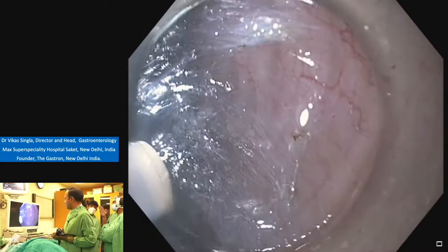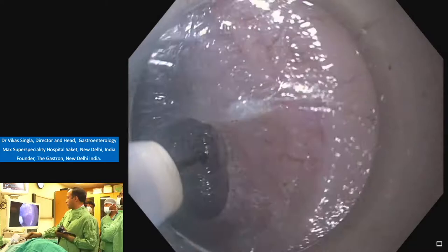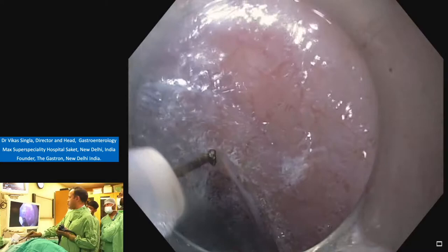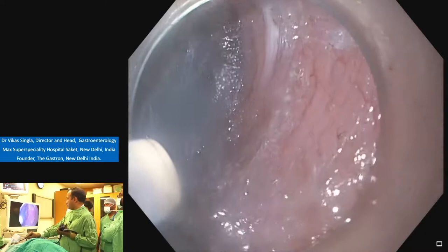So right now you can identify the striations. We can see the striations on the muscle layer. Again we are cutting fiber on the side. We continue the dissection. And you can see that our knife is directed towards the muscle only. So again, dissecting on the sides.